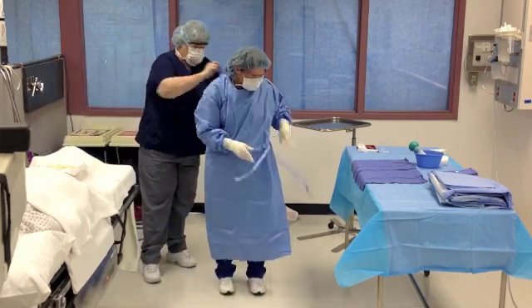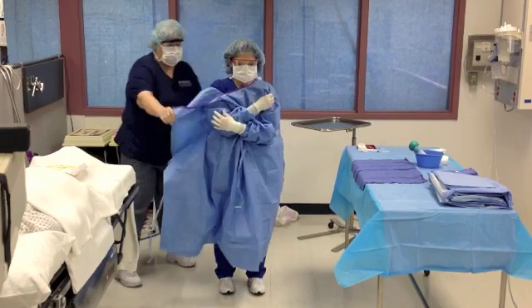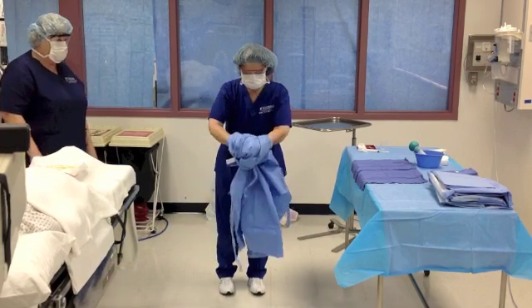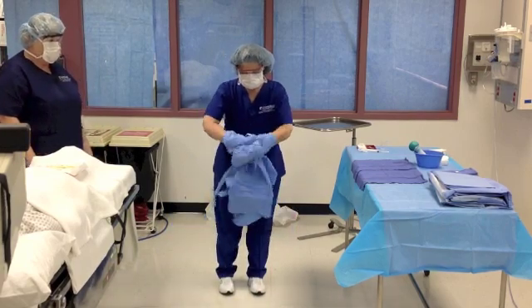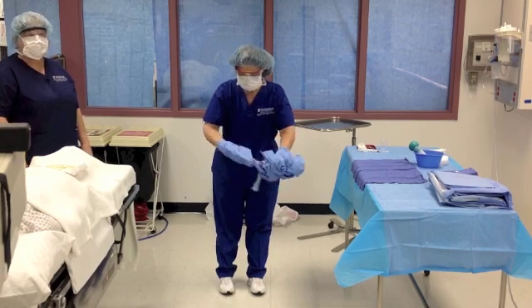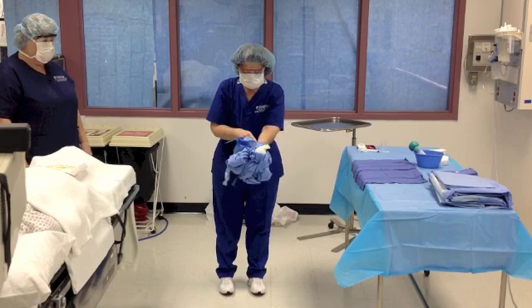The circulator can assist by untying the gown. Grasp the outside of the gown at shoulder level and roll the gown down and away. This rolls the gown inside out as it slides over your gloved hands. Roll the gown so that the contaminated outside faces in and discard it into a biohazard waste container.